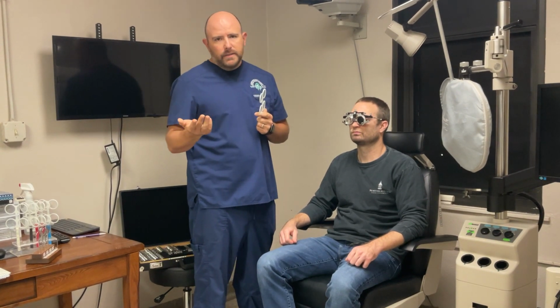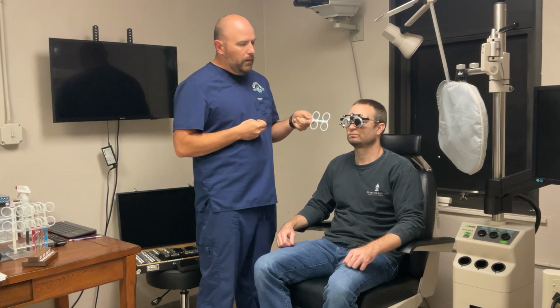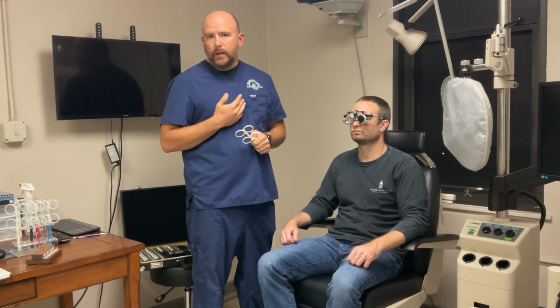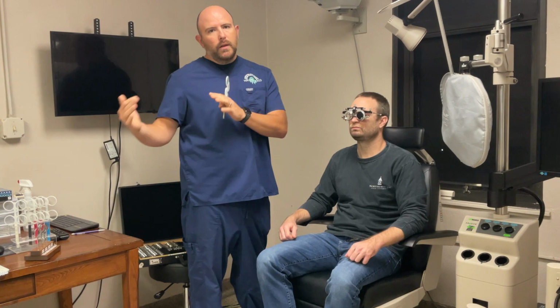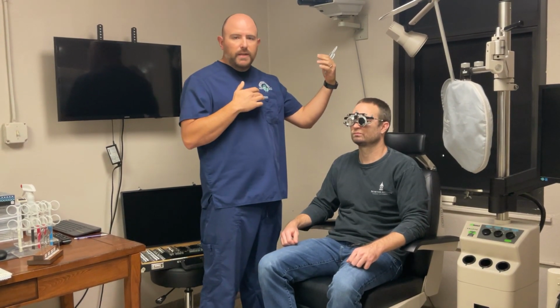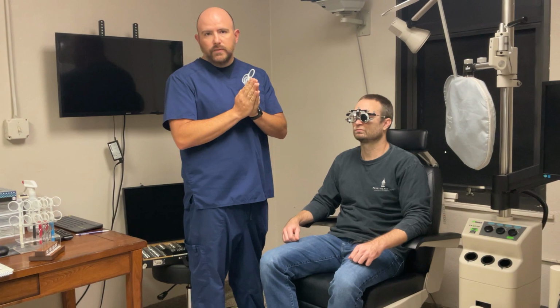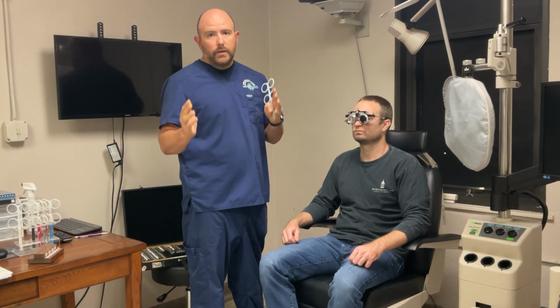As part of a final step, one thing that sometimes I'll check is, with the plus or minus half one more time. From the standpoint of the proficiency, at this point you are done because you found that the patient wants the 4.50, you checked on the low side at minus 3.50, you checked on the minus side at 5.50, and the patient doesn't want either of those options. You've bracketed, and you know that they're right there in the middle, somewhere around minus 4.5 diopters. So for all intents and purposes in the trial frame refraction, you're done.